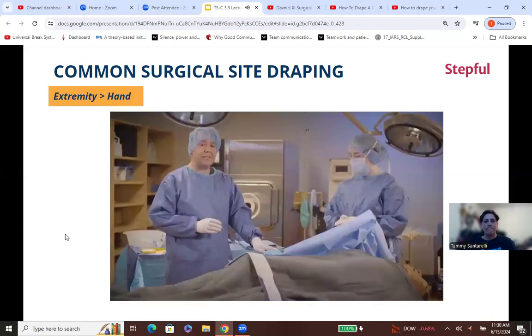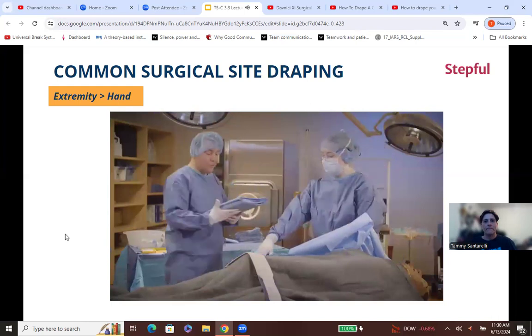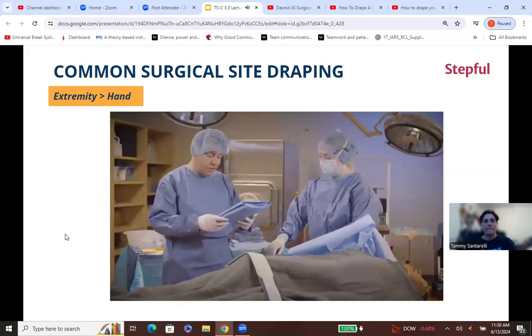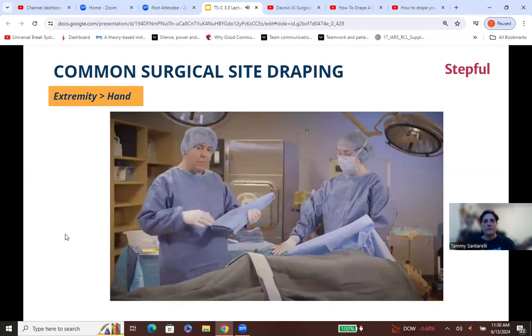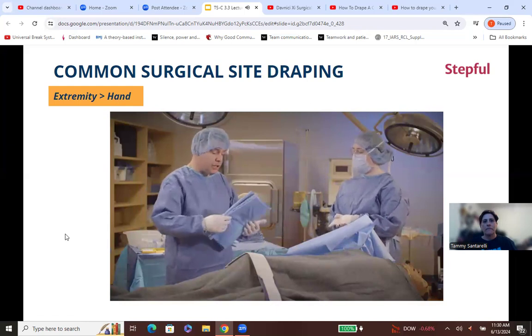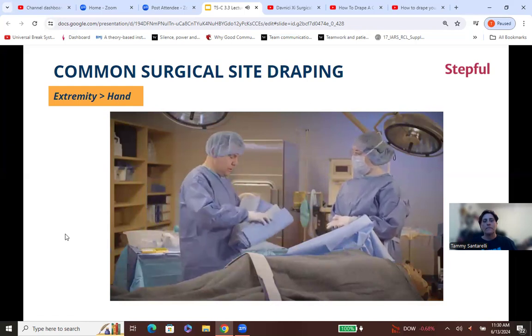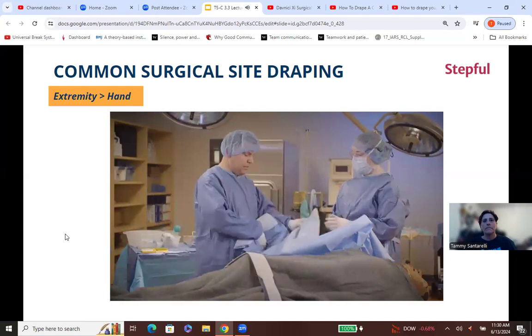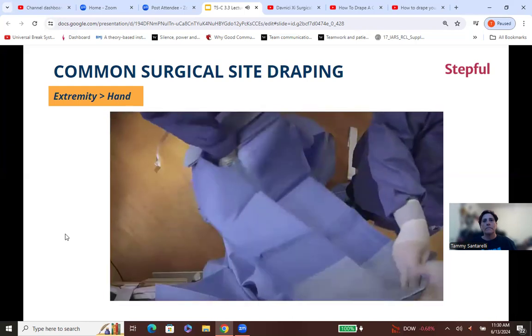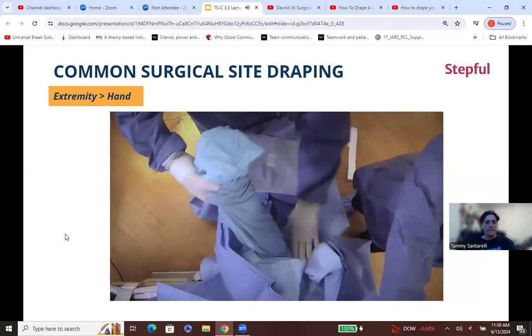All right, then lastly, we have the extremity drape. Manufacturers have done a great job with all these fenestrated drapes. They tell us which way to go for the feet. Oftentimes, they have a little person on them to show you where to place it on the patient. So I'm going to go ahead and put my hand in the hole. Grab this, please. And pull the arm through the extremity hole all the way up to the tourniquet.